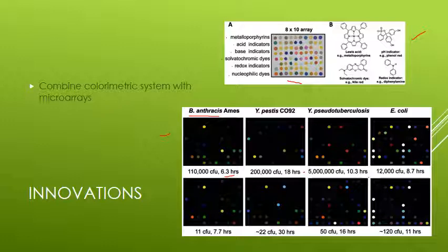And you can see the comparison that they're making. This is just one bottle here. So these are the gases produced at 7 hours. Or I'm sorry, it's read in this direction. So at 6.3 hours, we have these gases. At 7.7 hours, look at this, we have the next gases, okay? And so on down the line. Very interesting stuff coming down the pike.